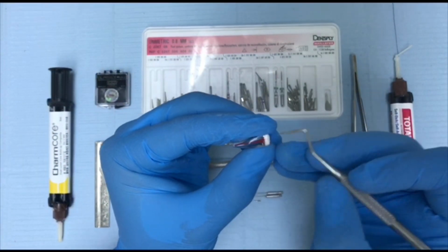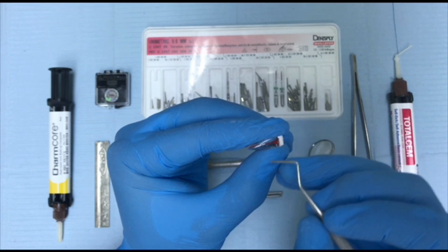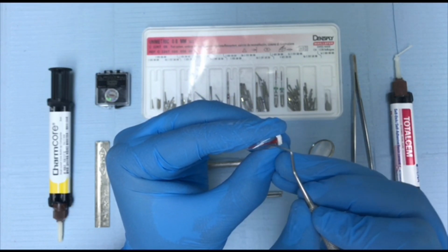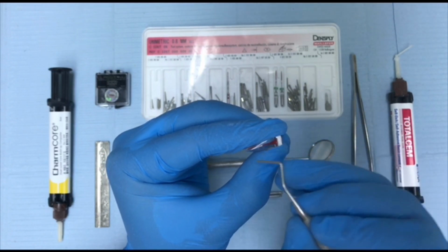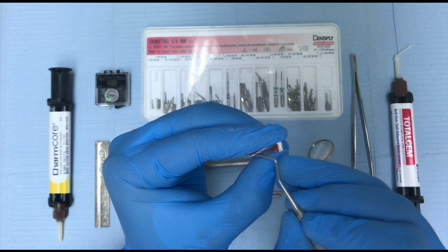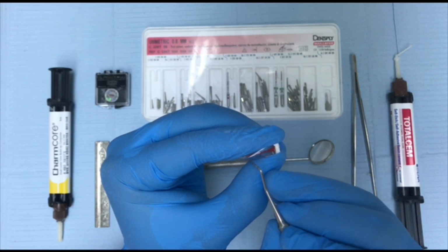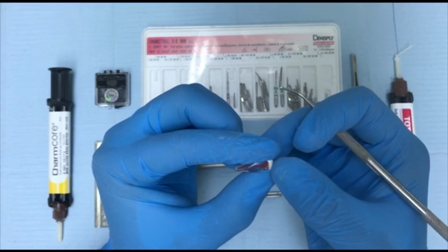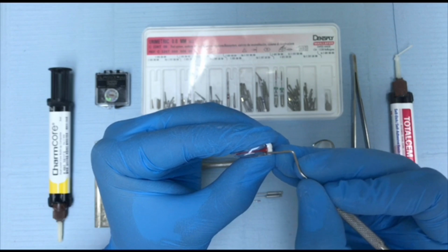Okay, now let's talk about the criteria of the posts. Regarding the length, the post should extend until it reaches 2/3 of the canal length, or it can be extended as far apically as possible, provided that you have 3 to 5 mm of apical seal in order not to violate the endodontic treatment that you have already done before. And post diameter should be 1/3 the diameter of the root.